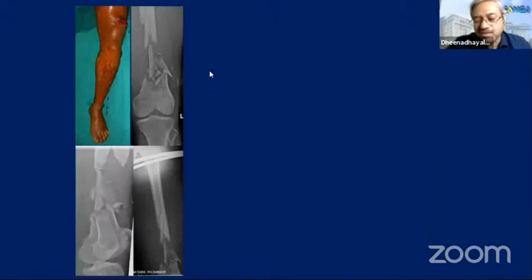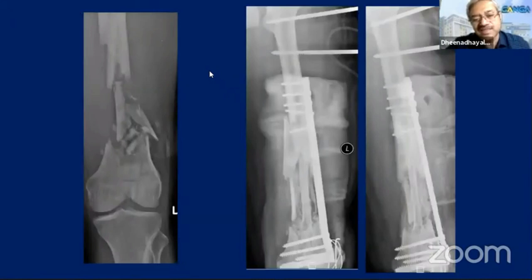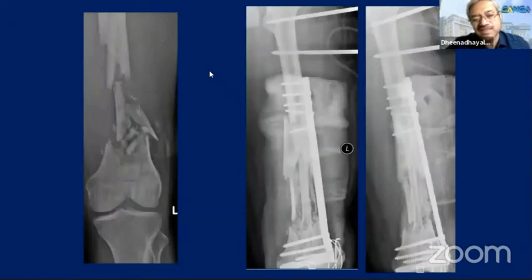This was a fracture with a Ganga Hospital score of 13, meaning staged reconstruction was needed. We maintained it with an external fixator because there was medial comminution. For any plate to work well, the opposite cortex must be intact — that is the principle. Because the opposite cortex was not intact, we used the plate and stabilized it with an additional external fixator so it didn't go into bending. These same principles should still be followed today.